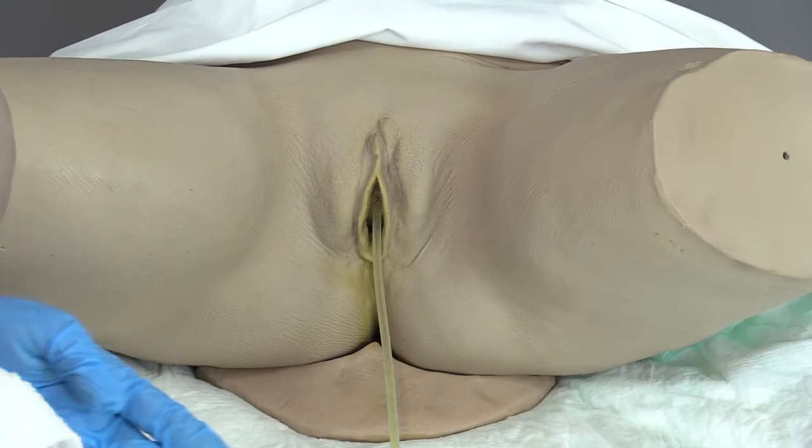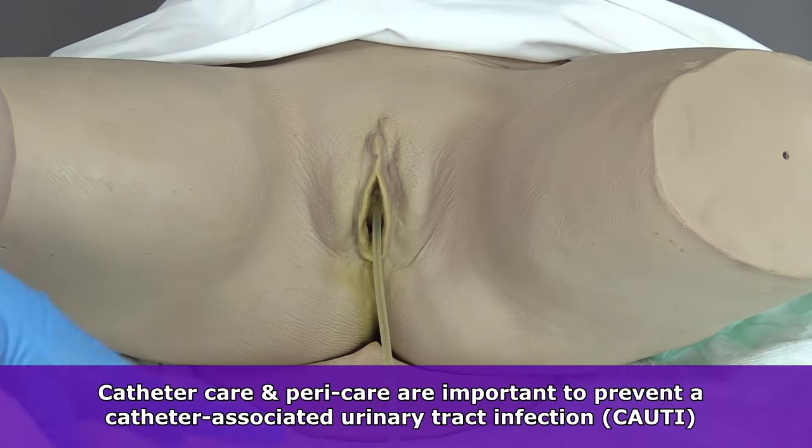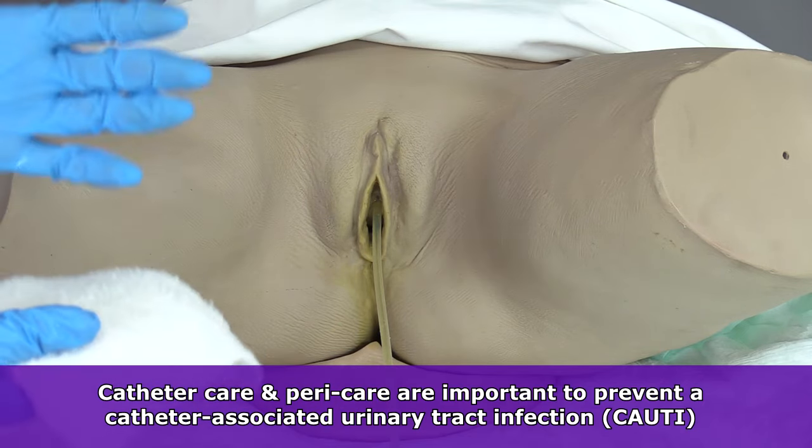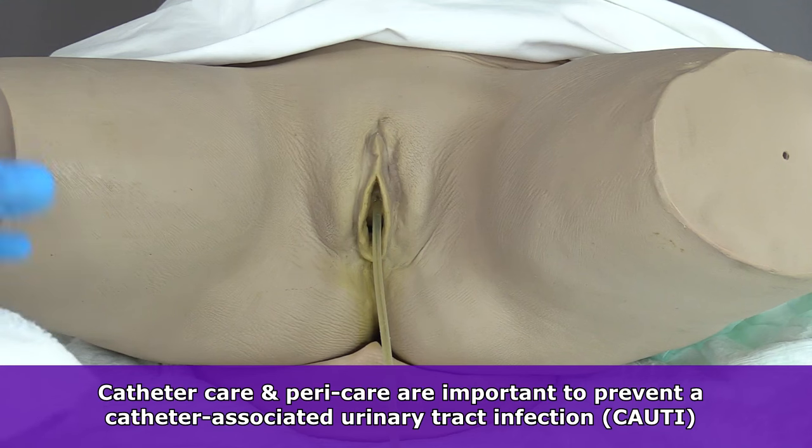The reason you want to clean the catheter is because this gets germs on it, and as germs get on the catheter, they can ascend, migrate up into the bladder and cause a CAUTI, which is a urinary tract infection. We don't want that for our patient.